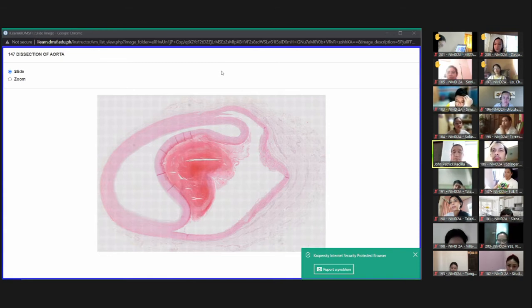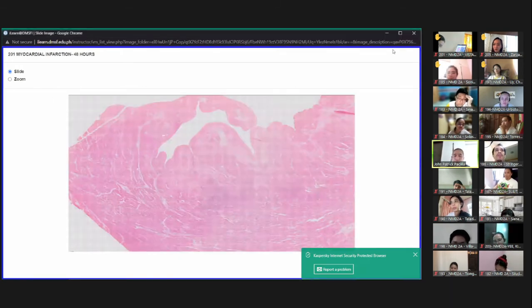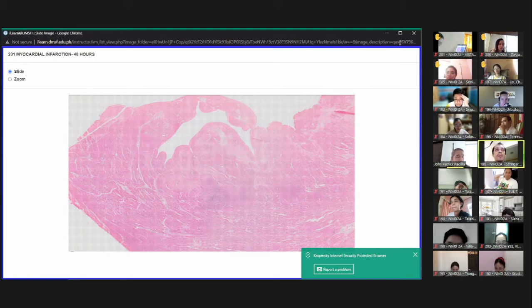So actually we have 5 slides for myocardial infarction, showing us the different histologic appearances from 48 hours or 2 days, then 4 days, then 8 to 10 days, and 6 months. So we are going to start with an acute MI, 48 hours, or myocardial infarction 48 hours. So what happens? Try to zoom.